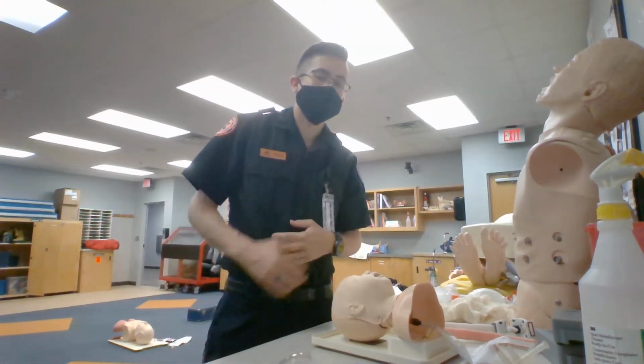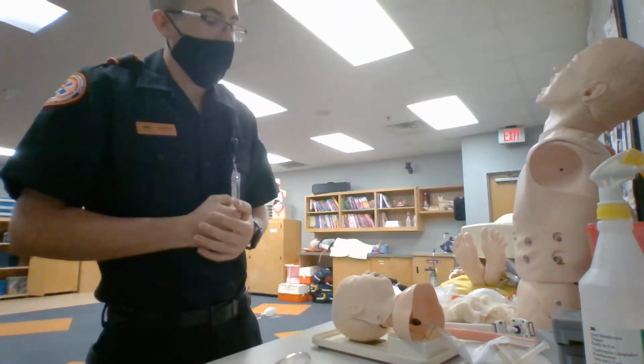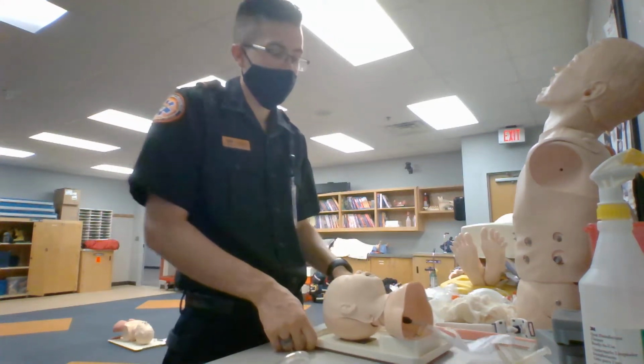Hello, my name is David Trimberger, and this is attempt number 5, a peer-to-peer direct oral pediatric intubation.